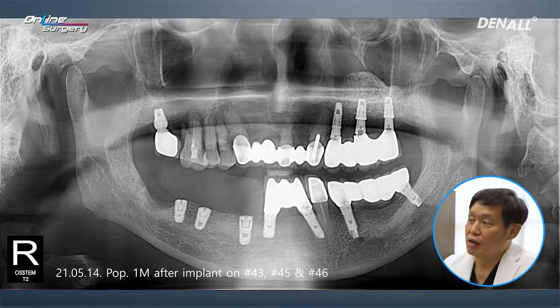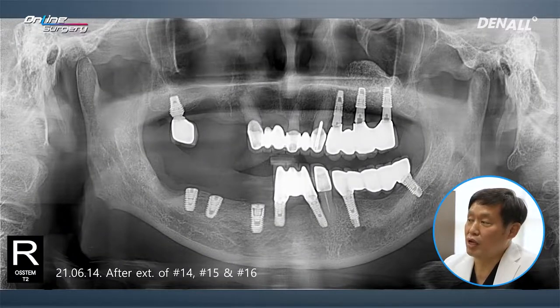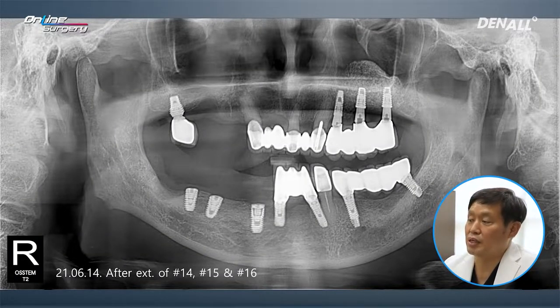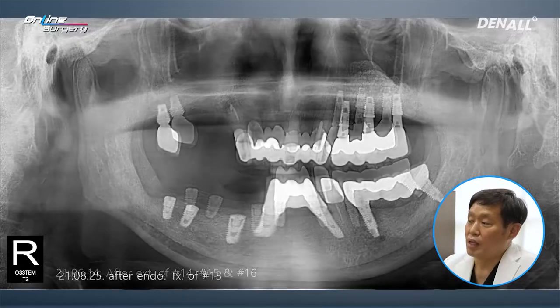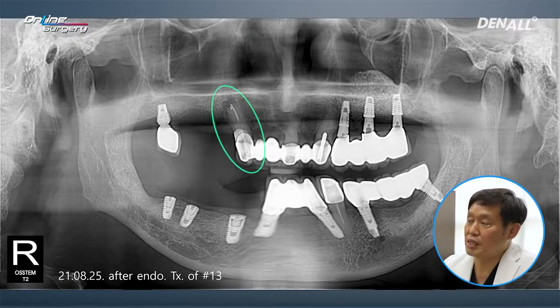This is after one month. Extraction was not done in the upper at that point. Three teeth — number 14, 15, and 16 — were extracted after that. In number 13, we did endodontic treatment.